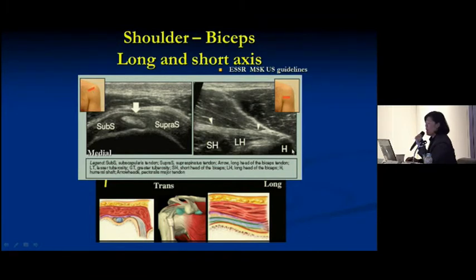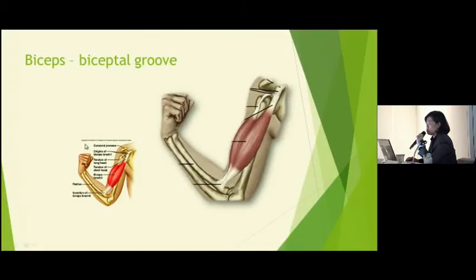Then you scan from above and scan down below. This is actually the PDF file from ESSR, the European Society of Musculoskeletal Radiology. They have excellent MSK ultrasound protocols, the ESSR ultrasound protocols, so you can see all the protocols.